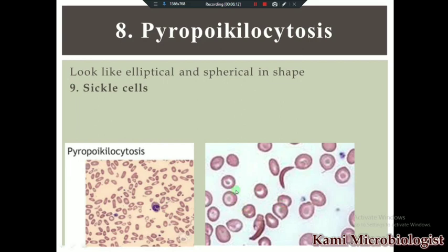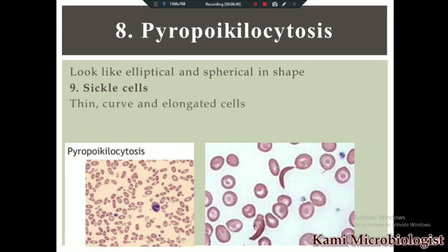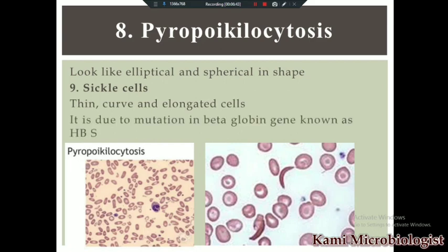Then we have sickle cells. Sickle cells are C-shaped, or sometimes very thin RBCs. When RBCs are in a sickle shape or C-like shape, we call them sickle cells. Sickle cells are thin, curved, or elongated cells, and they occur due to a mutation in the beta globin gene, known as HbS — hemoglobin S.